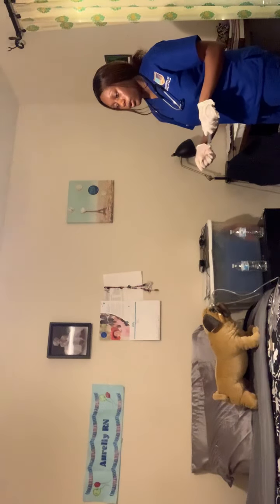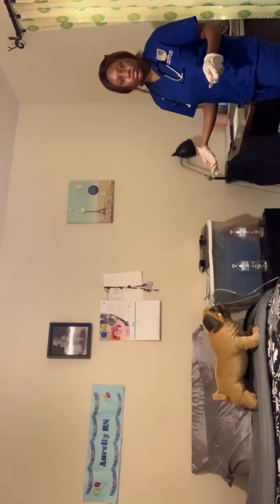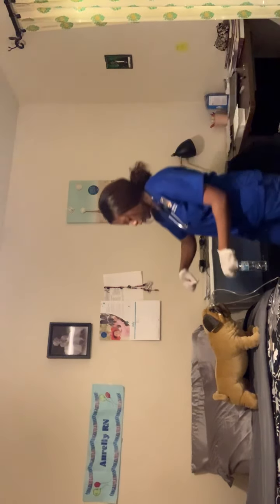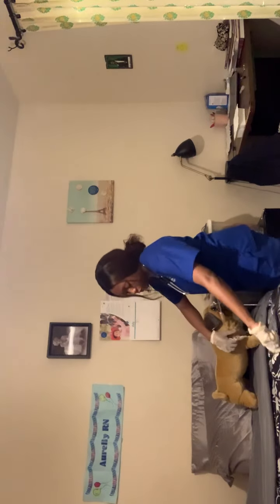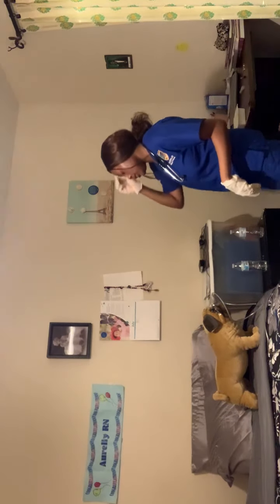And then I would also say that whether or not I need to replace the gastric content or just discard of it. I see that it is normal, so then I go and I anchor her tube to her gown, and then I clamp it with the container, and then I assess that her head is still at a 30-degree position.